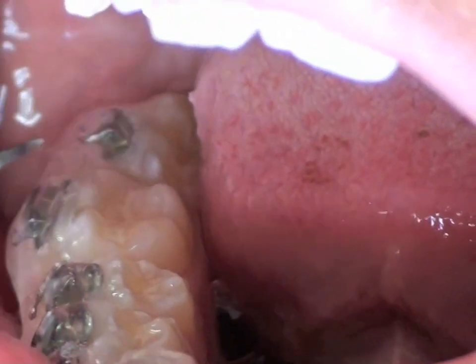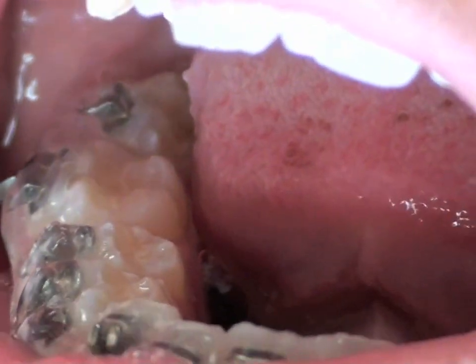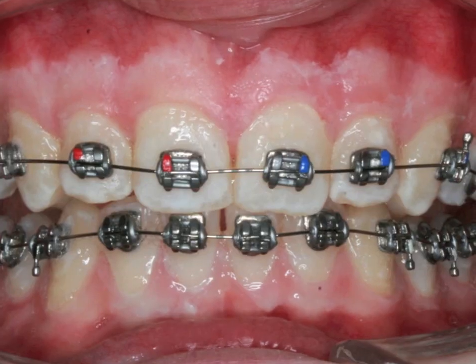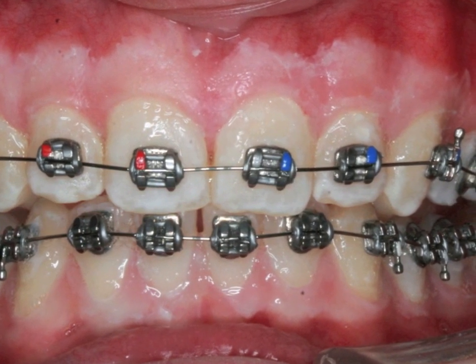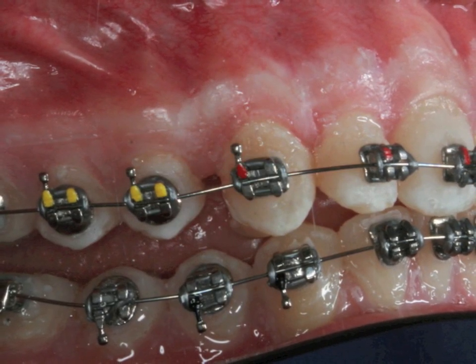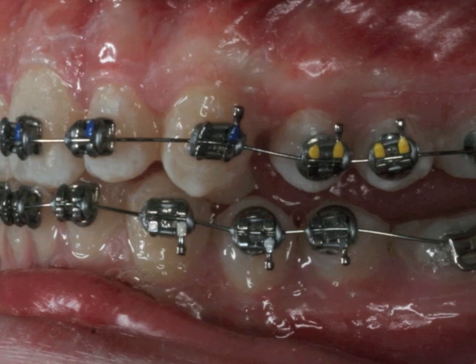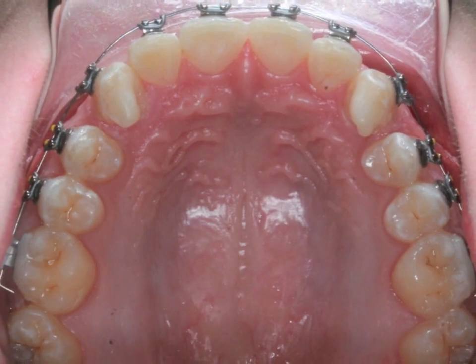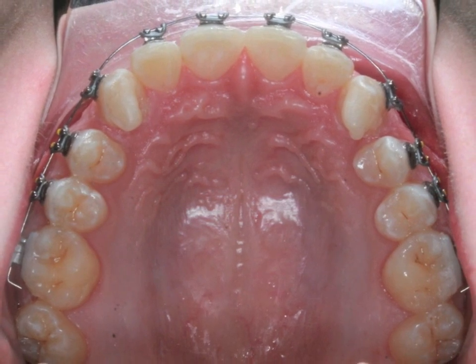Additional curing increases early bond strength after the outer tray is removed. After arch wires are replaced, bite bonders can be added to the anterior or posterior teeth depending on the depth of bite. I would like to thank Dr. John Kalanji and Dr. Duncan Higgins, who have guided me through the learning process of precision bracket placement.